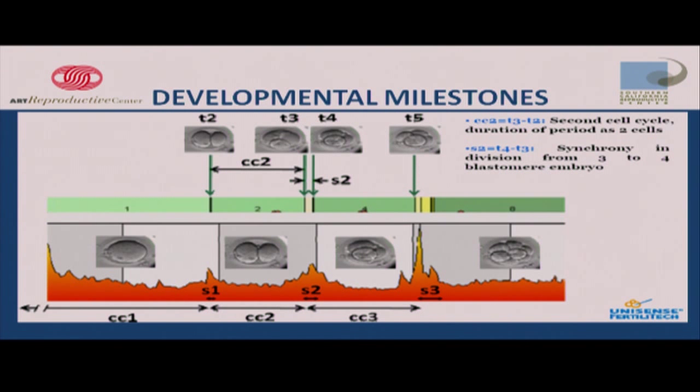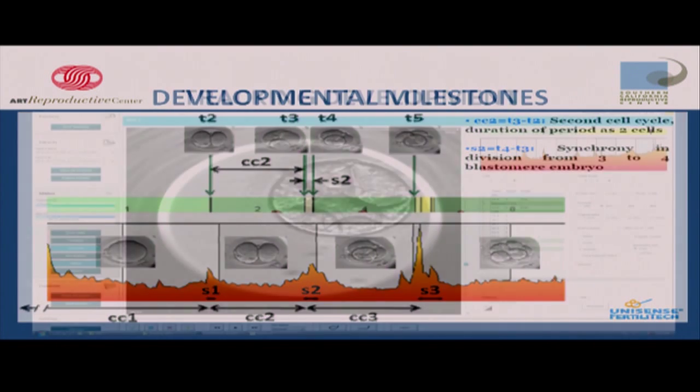So we can use those time points, time to get to 2 cells, to 3 cells, time it rests between 3 and 4 or does not rest between 3 and 4. Does it go too quickly between things? We use all of these things and start to rank which ones are the most important when we get past eliminating the abnormal divisions. So that's what we start to do.